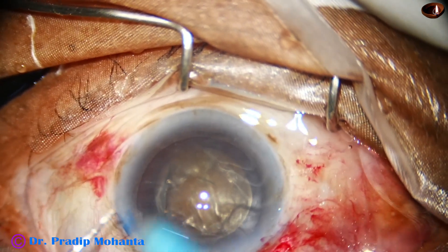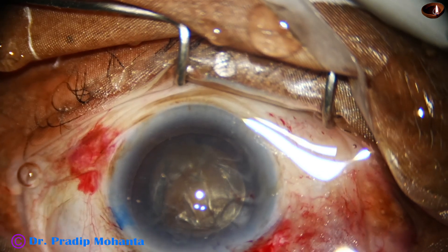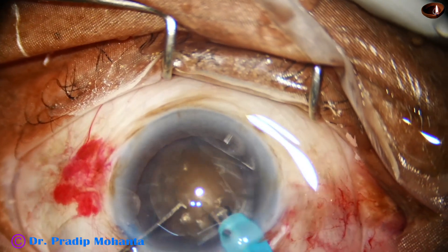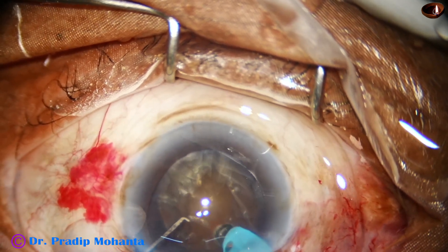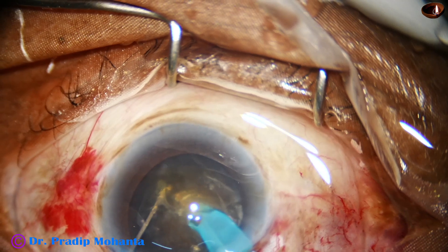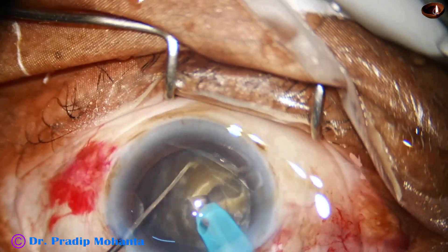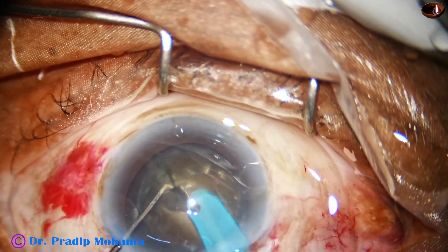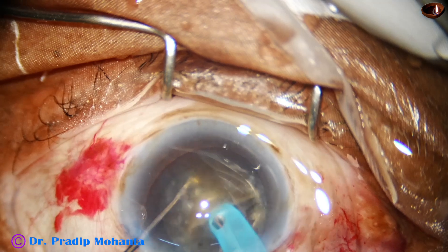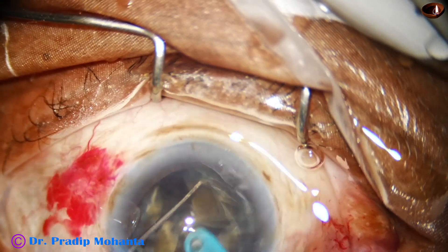And now the management of the nucleus. The tip must be exposed to about 1.75 to 2 millimeter in such hard cataracts to get adequate amount of ultrasonic energy. The tip is buried within the substance of the nucleus. Now it goes through the substance horizontally towards the opposite equator. As it reaches near the opposite equator, the nucleus is cracked, and we have got a very nice crack. Rotate 180 degrees, sculpt once, hold one side, and divide the two hemi nuclei completely. Now turn the hemi nuclei 90 degrees and divide each hemi nucleus into two fragments. If the hemi nucleus is huge, sometimes we divide the hemi nucleus into three fragments.